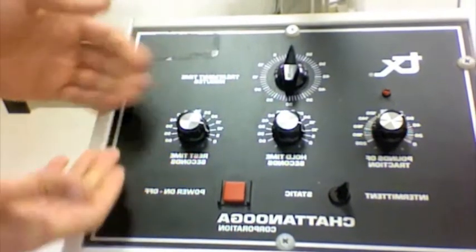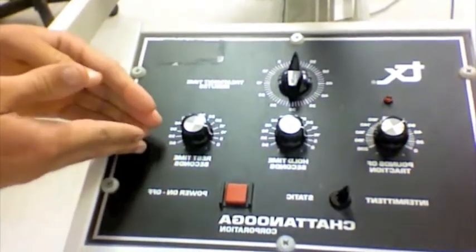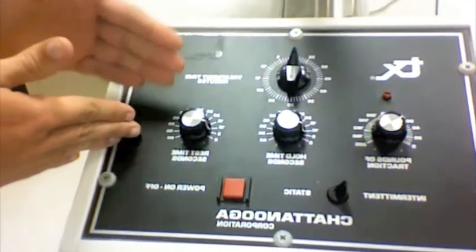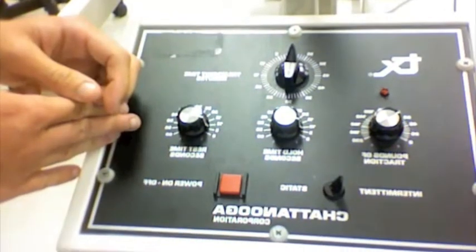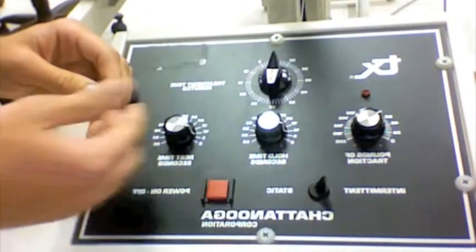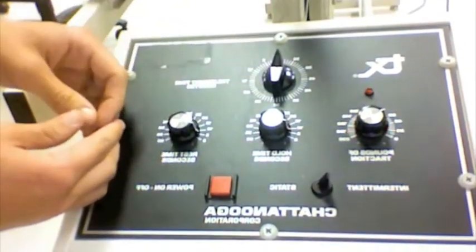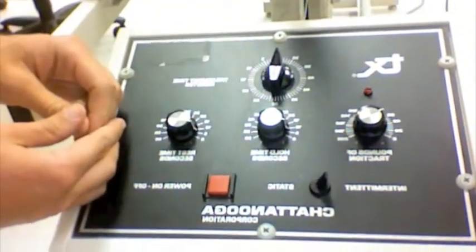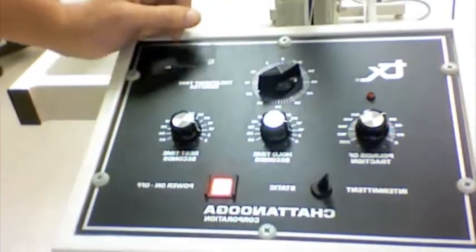Now that we're about to begin treatment, we're going to set up the parameters on the traction machine. Again, this treatment is for elongation of the soft tissue to treat muscle spasm. We're going to set the pounds of traction at 43 pounds, which is around 25% of the patient's body weight. It's going to be intermittent traction, set at a 5-second hold time and a 5-second rest time. The total treatment time is going to be around 20 minutes. So we can set that up now and begin treatment.